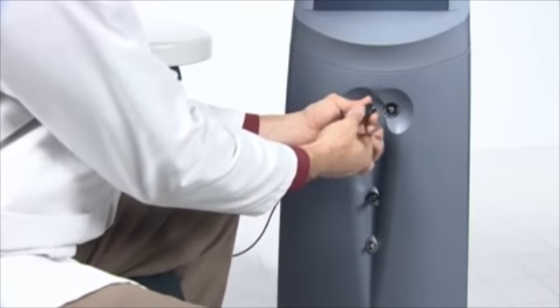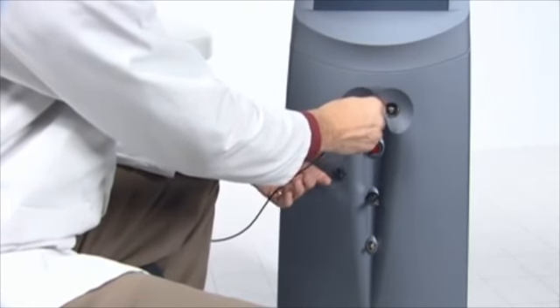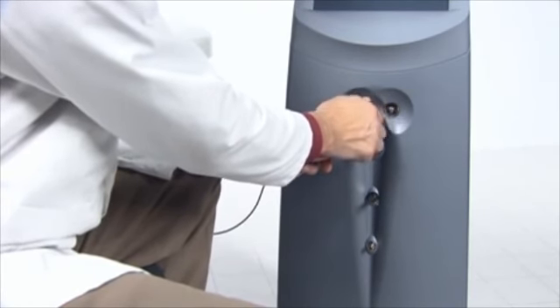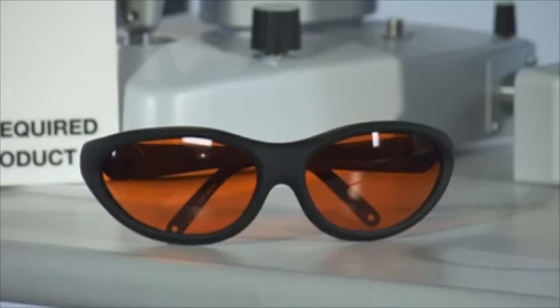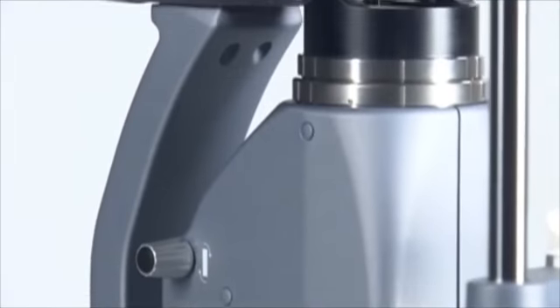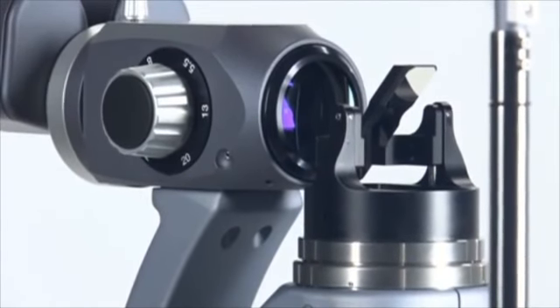Remember these safety tips. Always make sure the delivery device is properly connected to the laser. Improper connection can result in a dangerous inadvertent secondary laser beam, resulting in severe eye or tissue damage. Never substitute prescription eyewear for the appropriate laser safety eyewear. Prescription eyewear can concentrate the laser light to the eye. It might also be shattered by a high power density beam, possibly causing severe eye damage. Never look directly into any optical lens, optical fiber, probe, or laser system aperture while the laser is energized. Severe eye damage could occur.